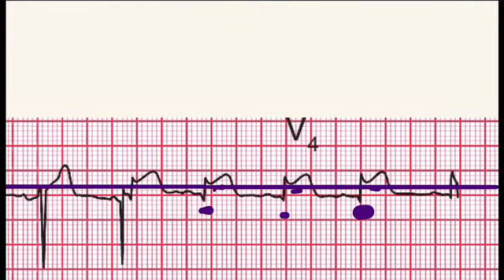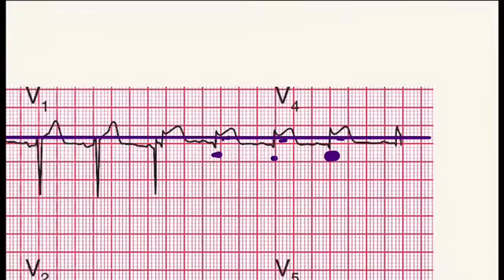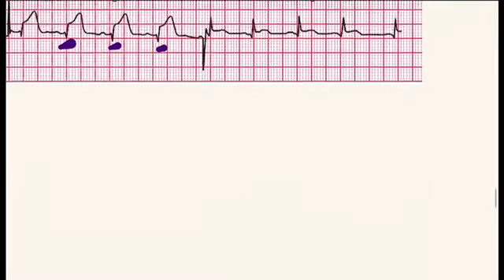That's the point of the basic concept that we talked about, that there is a relativity behind this: ST segment elevation and PR interval depression. And that is very important. So let's again come to the main point. The anterior infarction can be located in leads V3 and V4. Now let's talk about the next ECG.